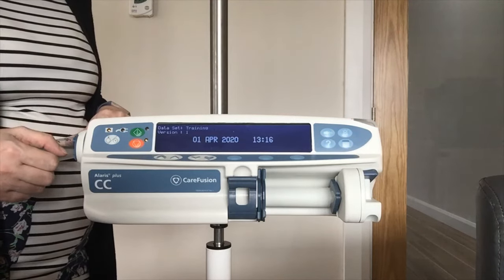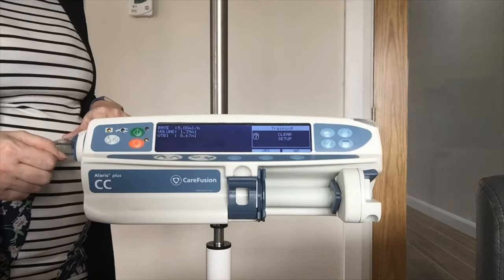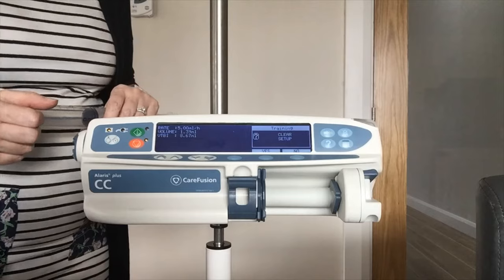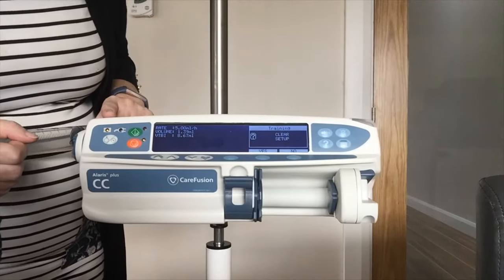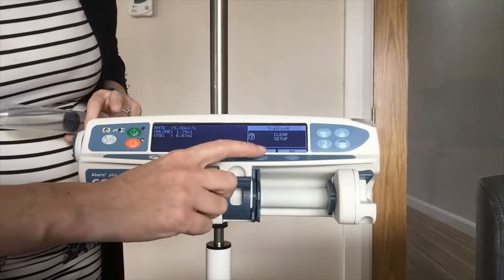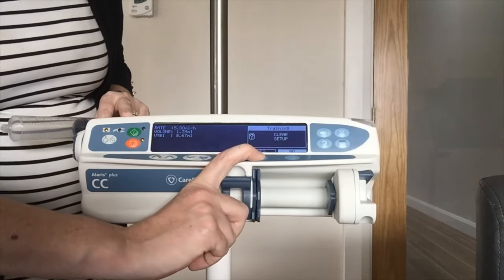My best advice with this pump is to follow what is on screen as it is actually quite intuitive, so we will follow what the messages are telling us. First off, it is asking me to clear the setup. If it is a new patient I am always going to say yes and default everything back to zero.